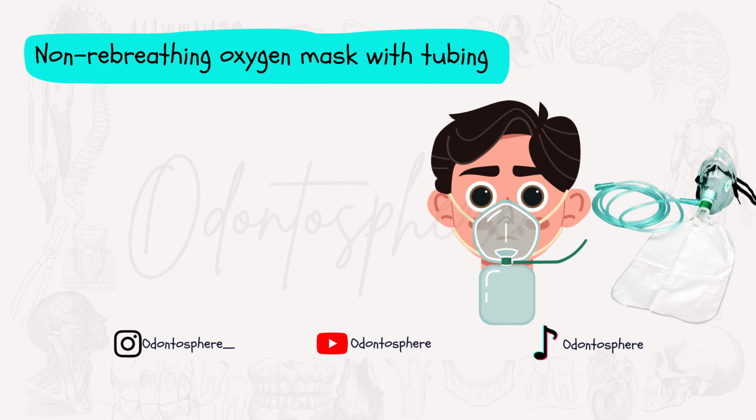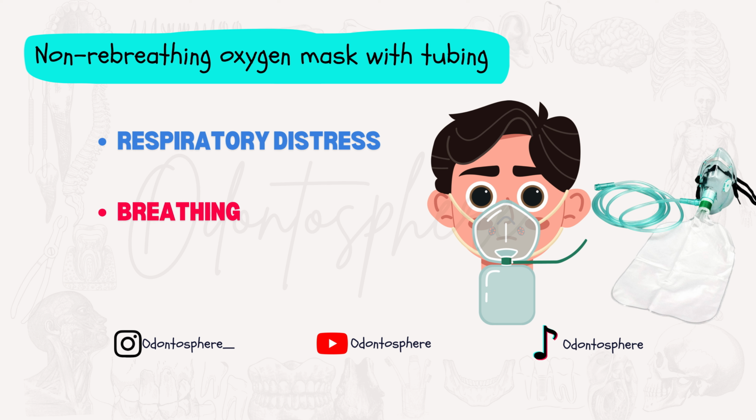The second equipment is the non-rebreathing or reservoir oxygen mask with tubing. This one is for patients in respiratory distress or patients who collapse. Remember that the key point here is that when we use this piece of equipment, the patient is still breathing. Okay? The purpose of this equipment is to deliver high concentration of oxygen for breathing patients.